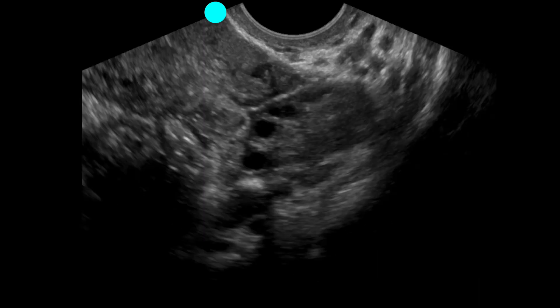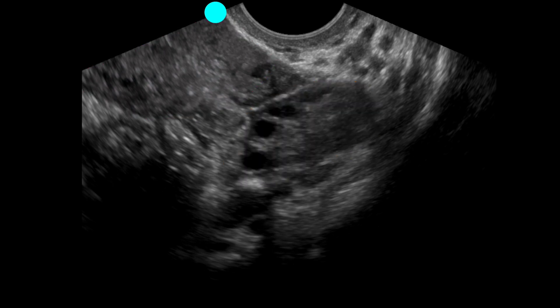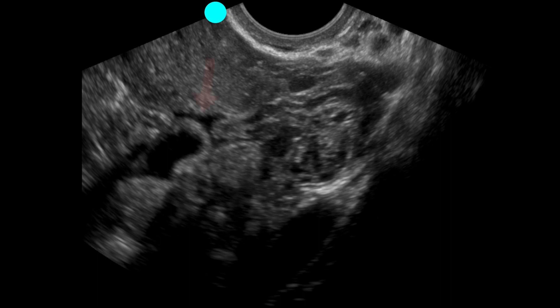We drag over to the patient's left and perform a similar exam looking at the left adnexa. Keeping the uterus in plane, we identify a structure with ovarian follicles — this is the left ovary. Scanning a little more inferiorly, we again note more free fluid.